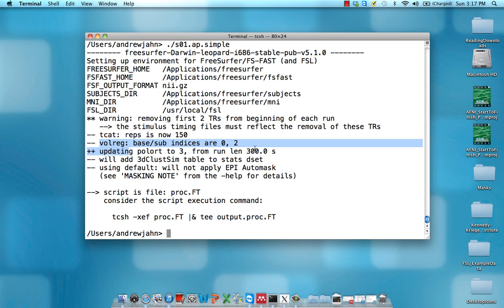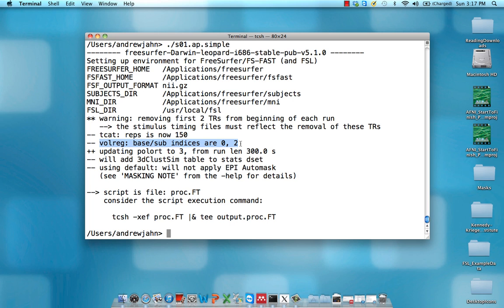Volreg based sub-indices, we didn't specify this in that command, so this is just going to the default. This is volume registration, and what this means is that we're going to be registering to the third volume of the first functional run. Remember that in AFNI land stuff starts at zero, so zero represents the first element of something.